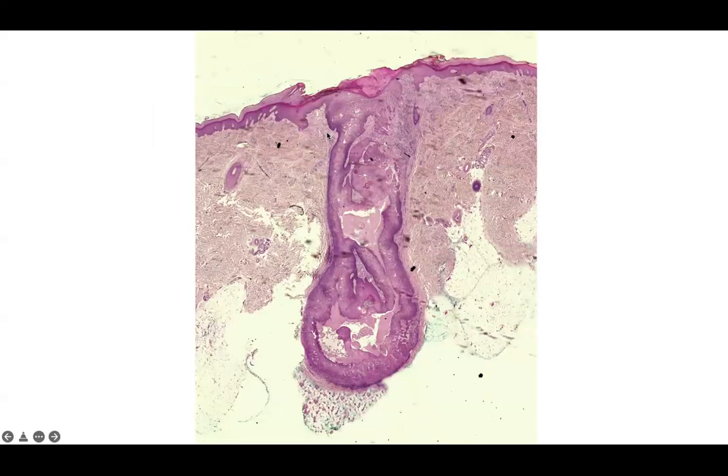So notice at low power that follicular extension and the endophytic proliferation. You've got a complex architecture. And if you were to just shave off the top of this, a dermatopathologist may be worried about the endophytic nature, but this is a nice representative excision to really illustrate this inverted follicular keratosis.